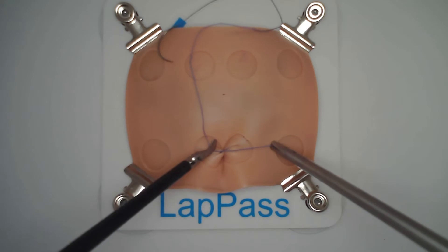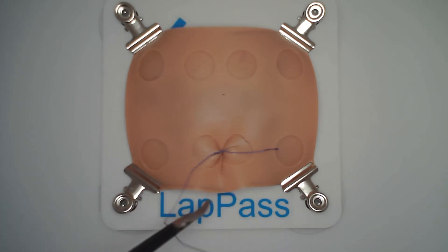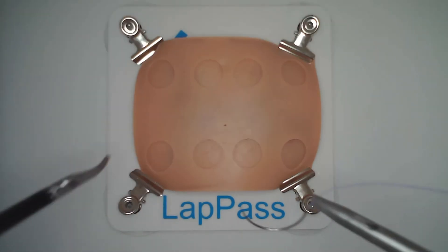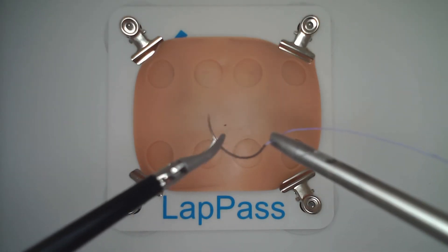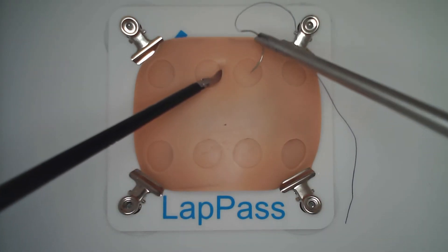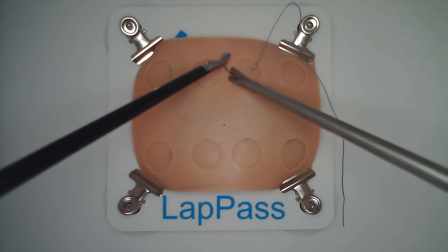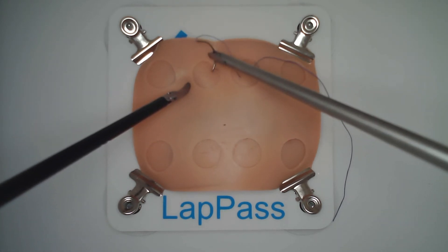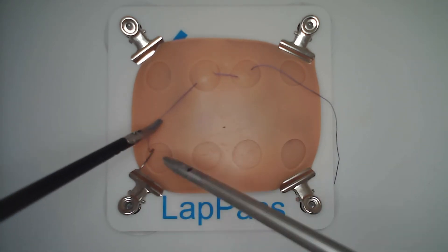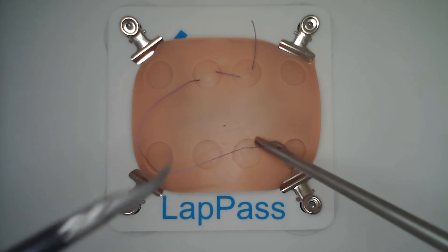With this particular model this is the best knot to practice. To finally secure the knot it requires a third throw in the same direction as the first. Key point here is to make sure you mount the needle correctly — you can do that pre-mounting outside the box or within the box, but make sure the needle is perpendicular to the needle holder. Always use the non-dominant hand to press into the tissues to get a good bite from within the circle of tissue, and use the needle holder to pull the needle through in line with the needle, then draw the suture through to create the classic C shape.